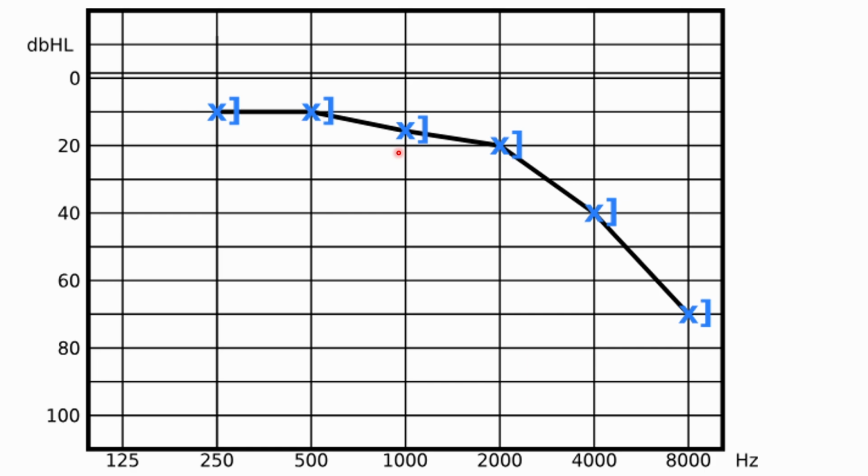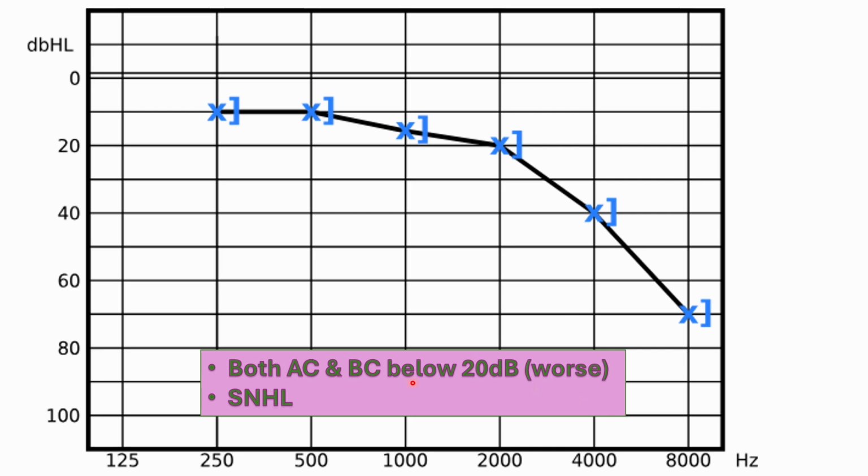So this is very important, because there will be no such hearing loss as such, but the hearing loss has started, and the nerves have started to get damaged. It can be present in age-related hearing loss, ototoxicity, noise-induced, or any other causes. So worse in high frequencies, but in speech frequencies it is normal.